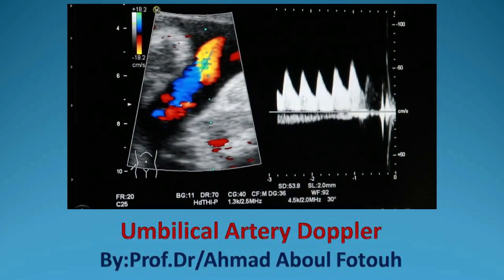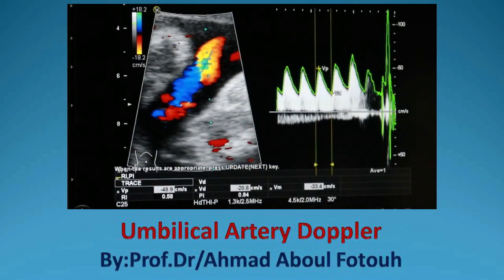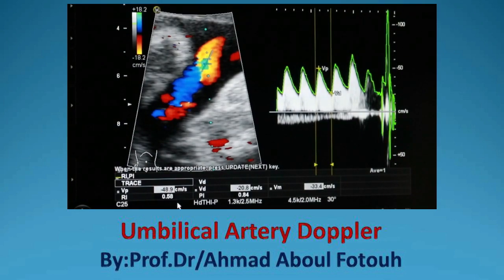I can take the measurements here — the automatic measurements — and the machine selects them. They appear reasonable to me. The resistive index is 0.58, which is very good for this age. The patient is 34 weeks, and the pulsatility index, when compared with the nomogram, will also be found to be well within normal range.